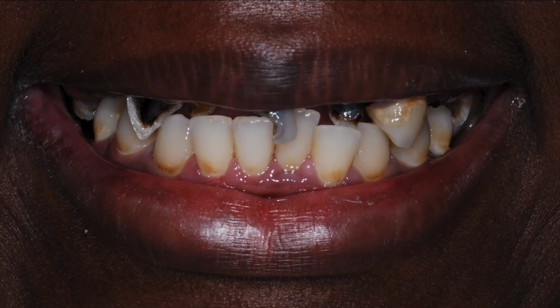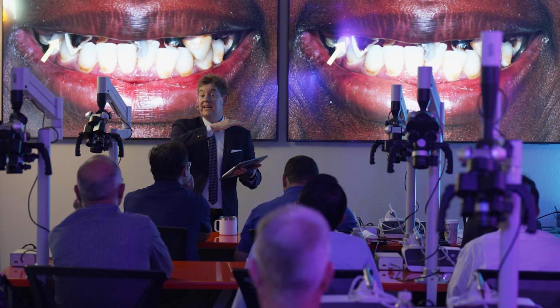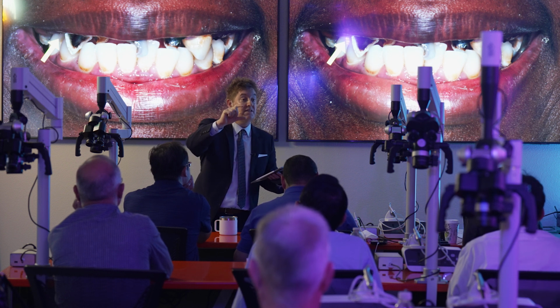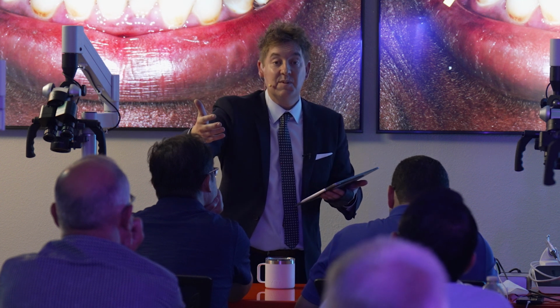But you just have to realize somebody has to understand all of this in the treatment planning process, and you need them in a vertical position, face shots, smile shots, so that you understand tooth position relative to their face, so that you get the bone out of the way to get the implants at the proper position to leave enough prosthetic space for whatever you've decided to restore the patient with. And remember, we established that the primary problem that we're having around the country is that we're not facially generating the plan and we're getting implants in and well integrated. And then when it comes to the restorative aspect of the case, we don't have the room to get it done without compromising something and paying some price for a prosthetic solution.